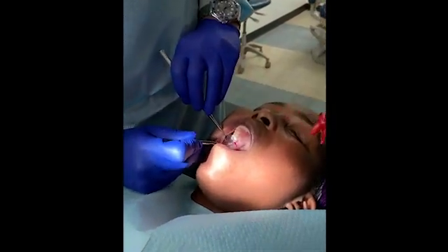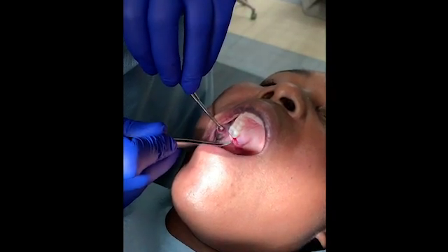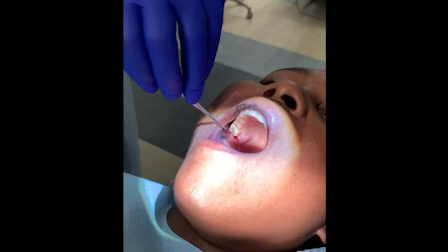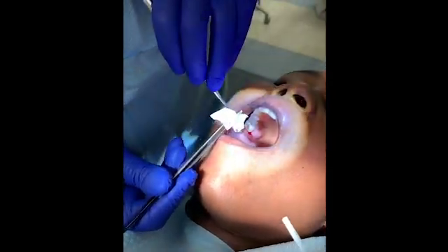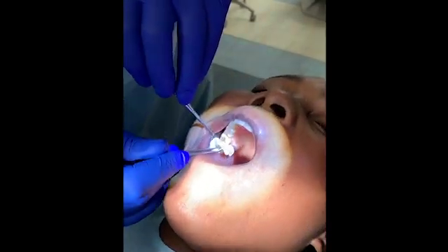We want to control the hemorrhaging here, or any type of bleeding. We're going to go ahead and use the BioViva material. The BioViva material is a cellulose and it's got a hemostatic agent in there, so we'll go ahead and put this right into the socket.